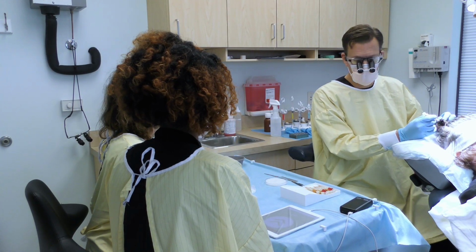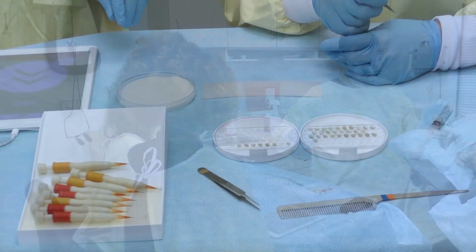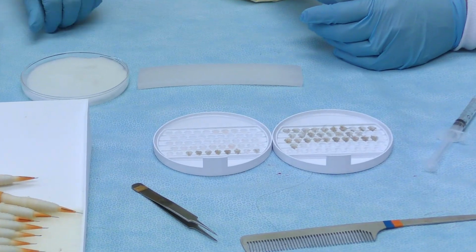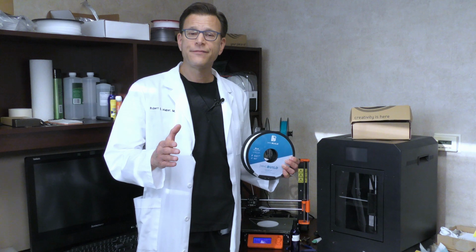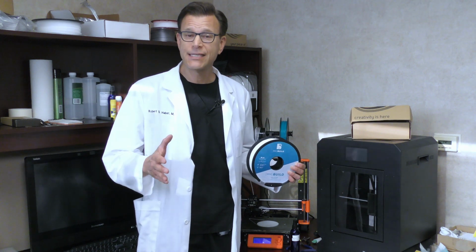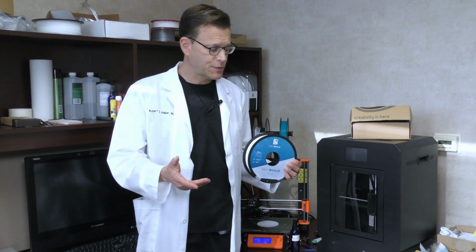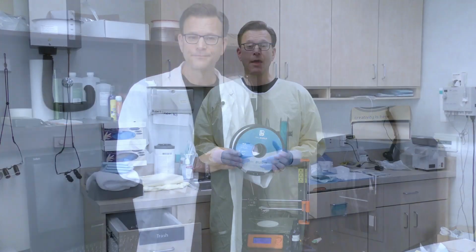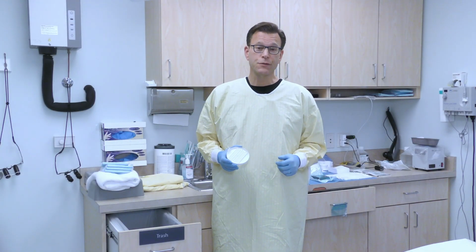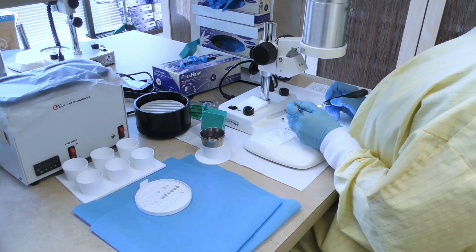As I plant grafts, I find it very helpful to look at the loading table and at a glance know exactly how many grafts of each size I have available to plant, allowing me to distribute the grafts appropriately. I have yet to find an autoclavable material that's easy to print with so that I can reuse these trays multiple times. So for now, I use a very inexpensive material called polylactic acid, or PLA, and discard the trays after each use. My staff love these trays as they have improved our workflow and graft handling.